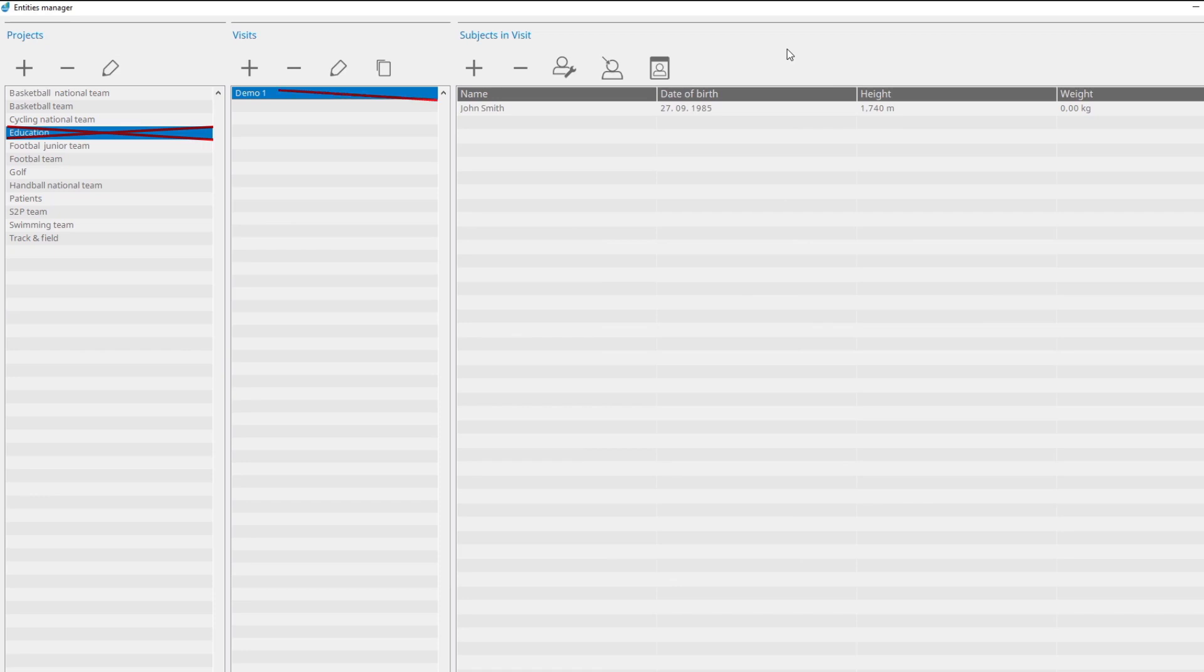When a visit is deleted, all measurements assigned to the visit will be permanently deleted from the database. By clicking the Remove button on the Subjects in Visit panel, you remove the subject from a visit, and all the subject's measurements for the visit will be permanently deleted.